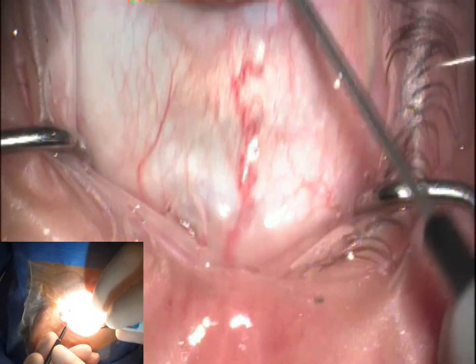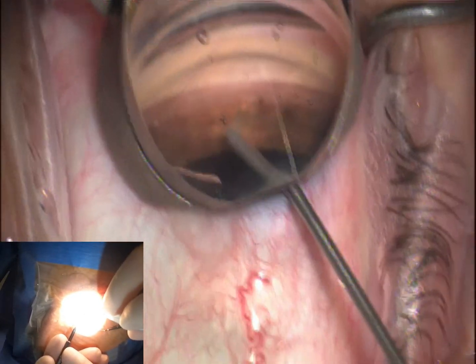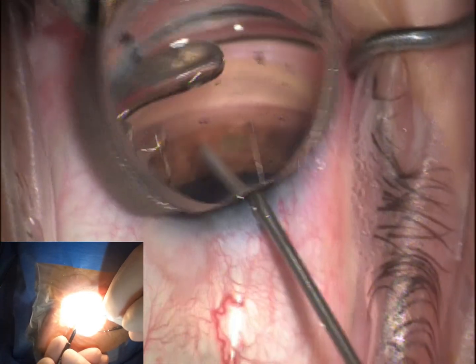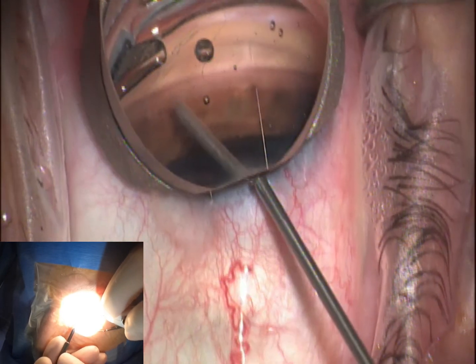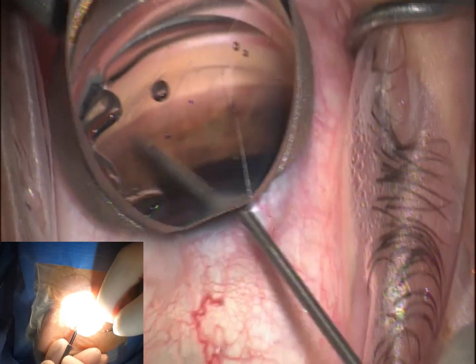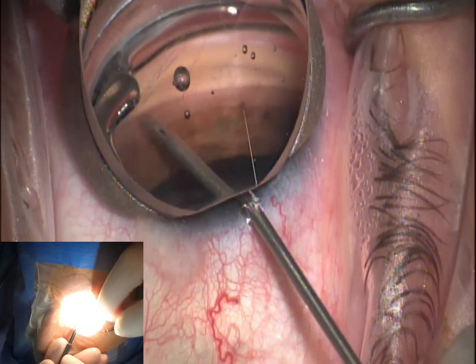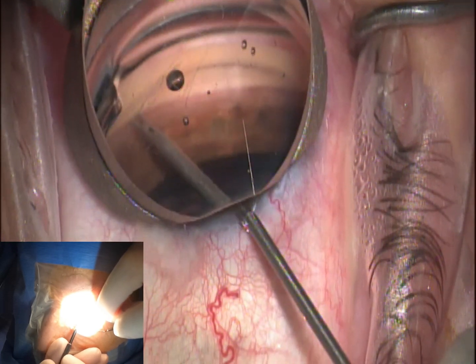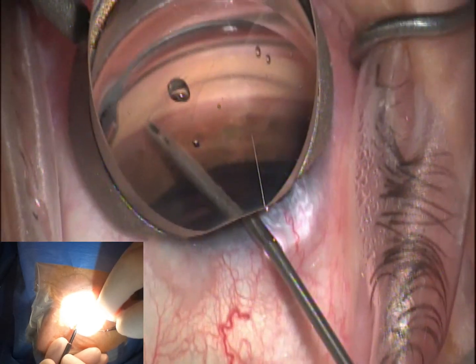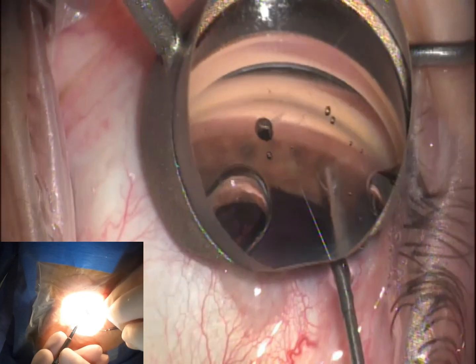I'm going to drop my gonio lens. I'm actually lifting the eye sometimes with the injector itself — if you see me relax, the eye comes down; if I put it in and lift, I can visualize the angle quite nicely. Pulling back on the injector, you can see that needle tip sitting right where it should be — a nice pigmented area of trabecular meshwork, telling me there must be some form of collector channel in this region. I'm going to insert the tip of the injector — you don't need to tent as hard with this version — and inject. It goes in perfectly, just like that. A nice little blood reflex. I'm going to rotate to the other side.